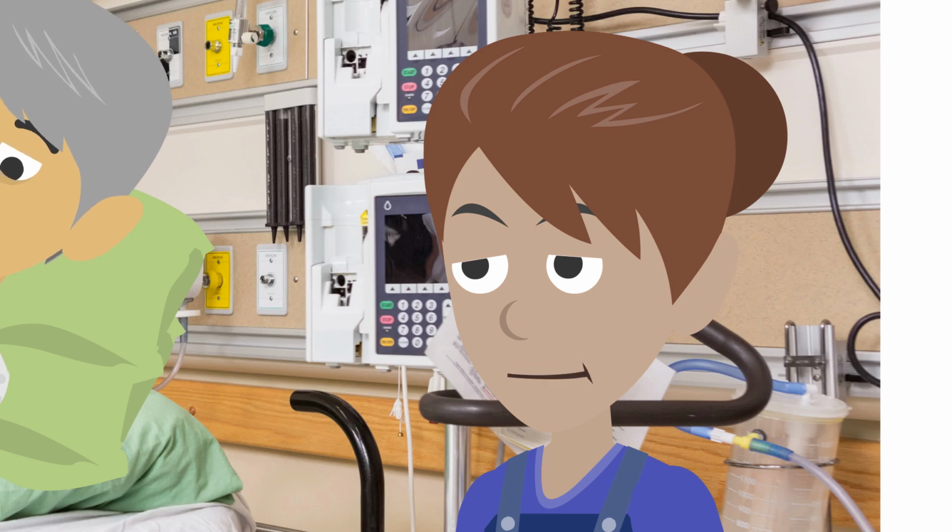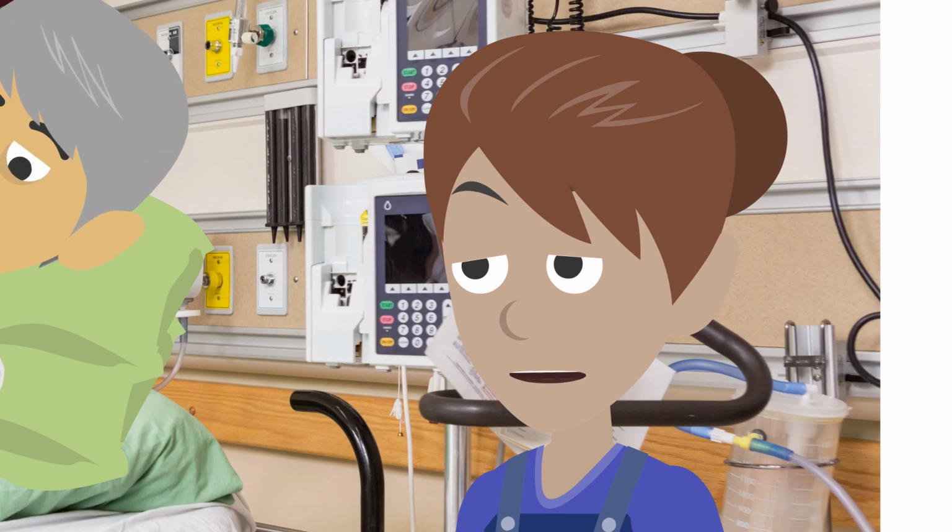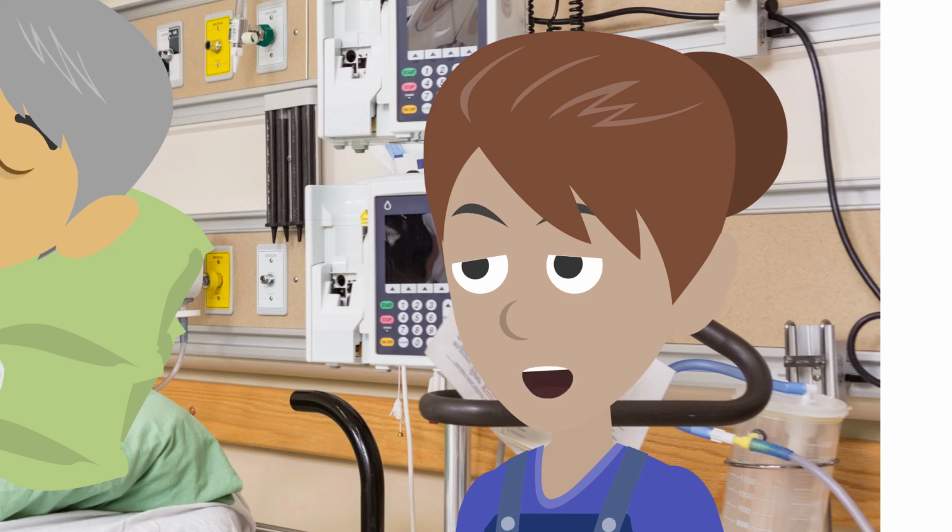That's great. I'm just going to lubricate the end of the tube with some warm water to help the tube go in more easily. I'll put the vomit bowl next to you so you can reach it easily in case you need it. I've also checked that the oxygen next to your bed is working in case you need some. There's bedside suction on the wall as well.